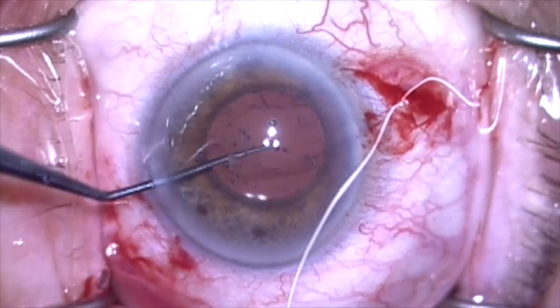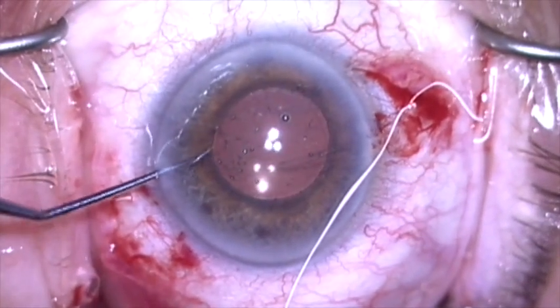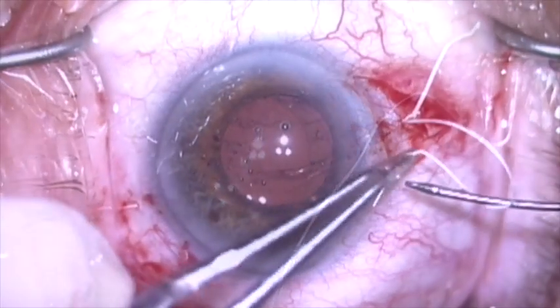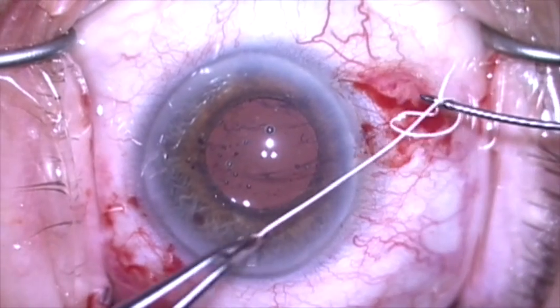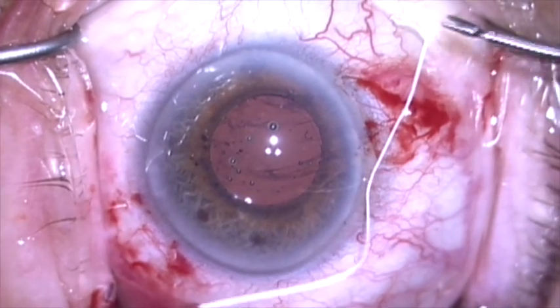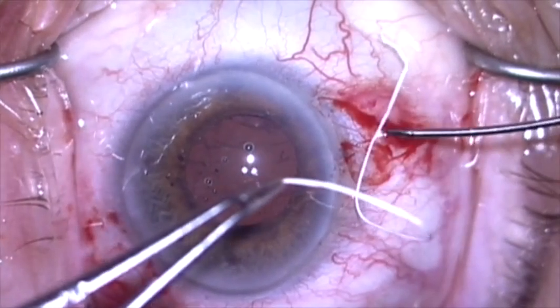I'm going to put a little pressure on the lens here with a Sinsky hook, and you can see that it's really very nicely secured, very stable and centered.